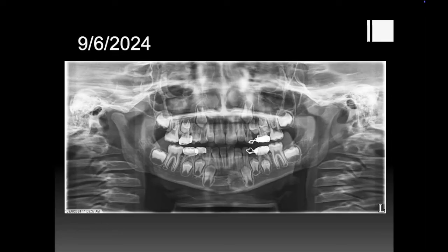So my recommendation would be we cover as many of the teeth as we can. I would cover the posterior teeth, and we'll work through this after class, but we need to design the appliance and how that would work. But we'll want to cover the molars, of course. We'll want to cover the primary second molars. Hopefully they're not mobile at all. That would be something you want to check clinically. And I would cover all the way up to those primary canines, creating basically one unit with the expansion to get as much anchorage and as much skeletal change as possible. So that's how I would design that expander.